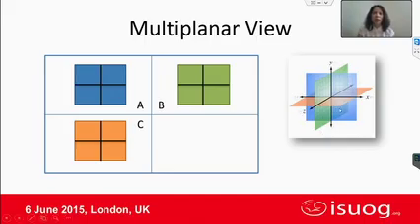The green plane is the plane that we cannot detect while rotating the transducer, and if we want to see it with a 2D, we have to change the position of our hand. All three planes, the orthogonal planes, intersect at one point here, which is the dot of interest.